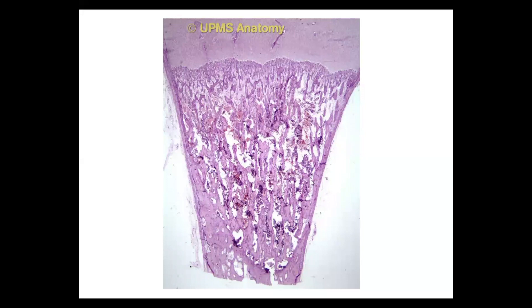Endochondral bone formation, HND staining. This picture is taken from our internet website, where you can excellently see the bony collar. This is the bony collar forming first around the shaft of the bone. This territory is formed by desmal ossification.